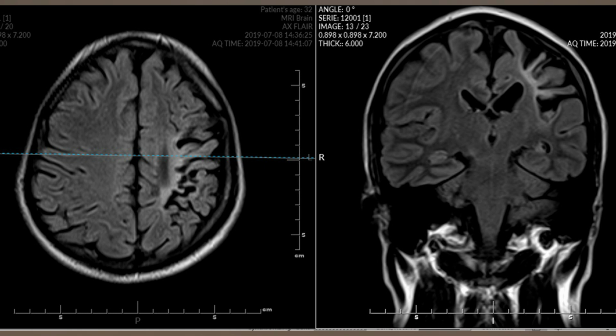This patient was coming up with uncontrolled epilepsy, not being controlled, never had a brain scan before. That's very interesting in Pakistan. Never had a brain scan. We did the brain scan. I said, I never do CT scan, I do MRI. First you spend 5,000 rupees, then you spend 7,000, 8,000 rupees again. Okay, so we did this, we find this, in this patient.